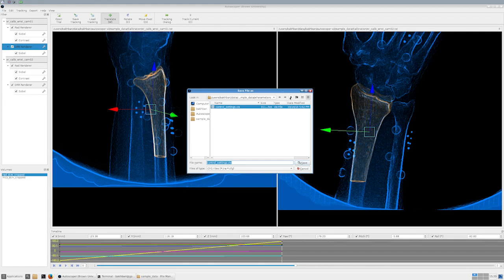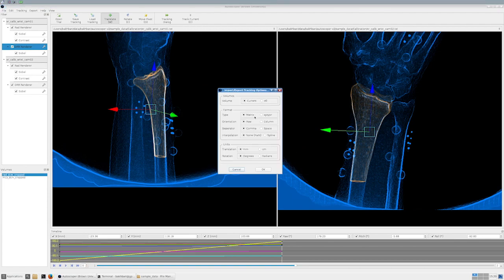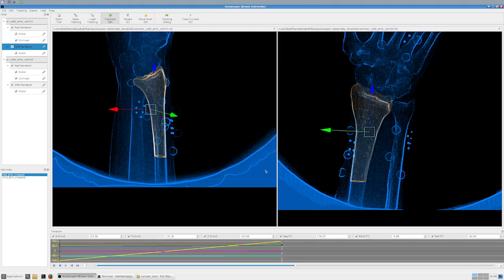Finally, to save your data: press Save Tracking and provide the output path, for example 'wrist_sample_radius'. Data is saved as a .tra file. You can set options such as matrix format, writing everything in one row, and comma-separated values. I'll explain all of these options in detail in a later video. Pressing OK saves the data.